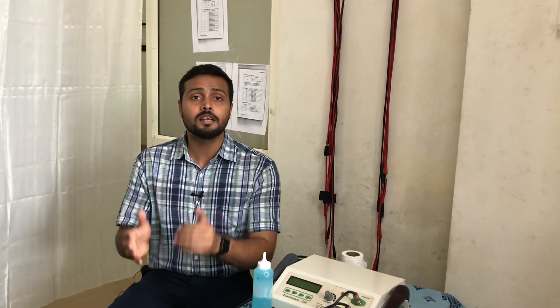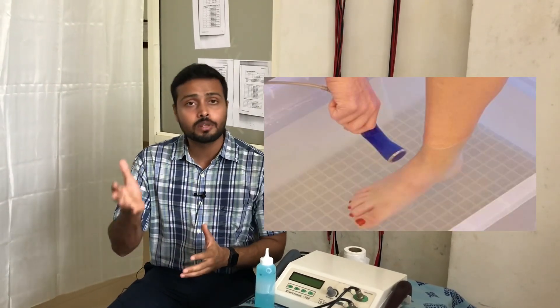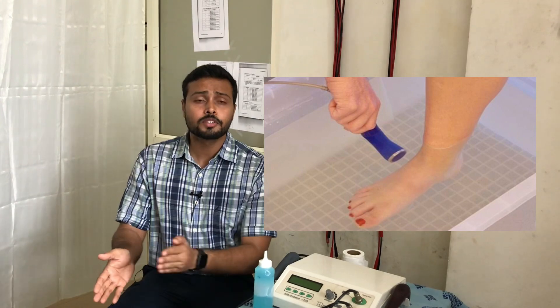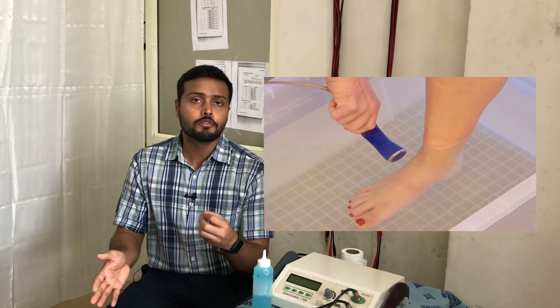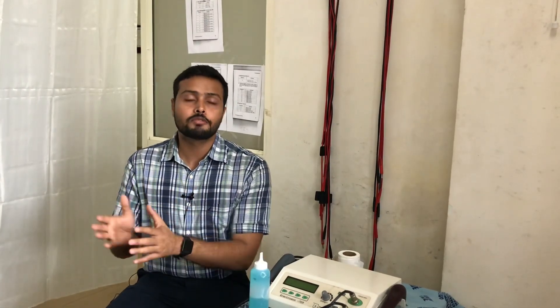In the water immersion technique, the patient's limb or the affected area is immersed in water and the ultrasonic wave is transmitted from some distance. Due to the rule of attenuation, there will be more reflection because the distance is greater, but still some absorption of the ultrasonic waves will occur.